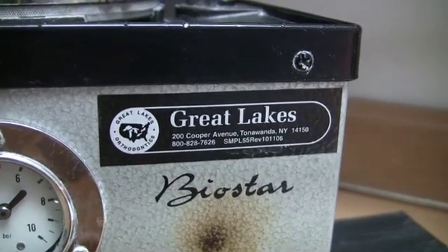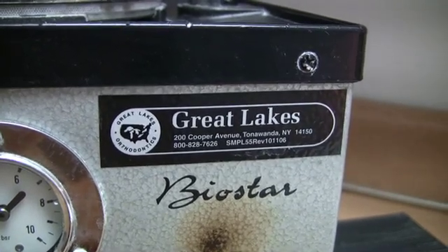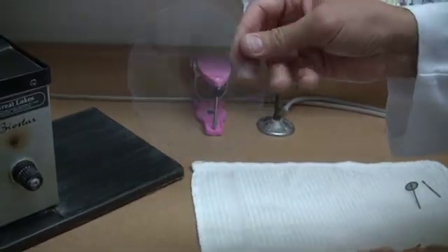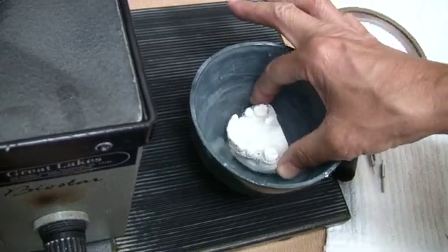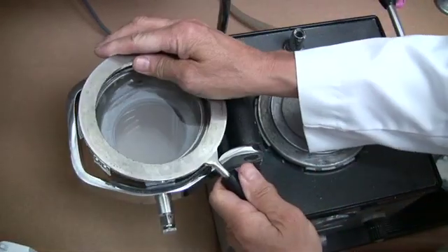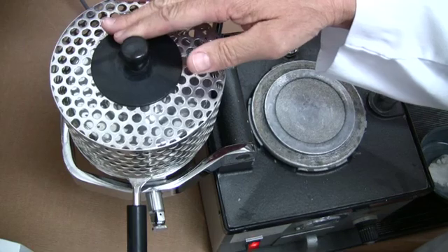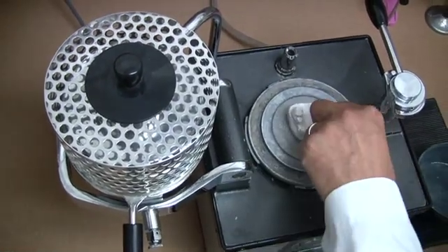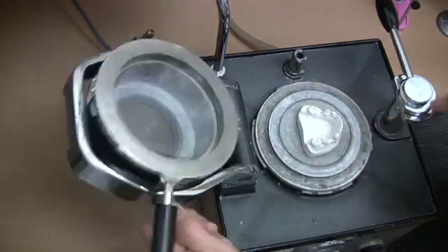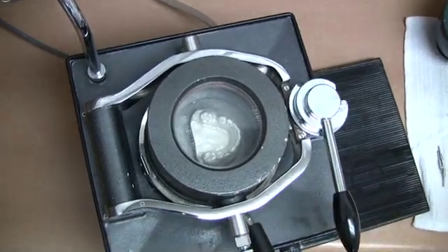I like to use a Biostar pressure molding machine manufactured by Great Lakes Orthodontics with Invisicryl A.040 material to fabricate my guide. Prior to molding, I would recommend soaking the model in water for a few minutes to prevent the material from sticking to the model. This material is flexible to allow you to remove it from your stone model without breaking the teeth and easy to insert in the mouth. Polymethyl methacrylate will bond to this material, which allows you to add acrylic to the A.040 material to make it rigid for stability where it is needed for preparing the implant osteotomies.